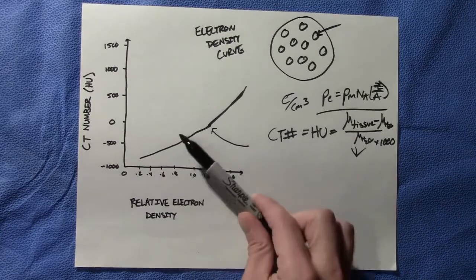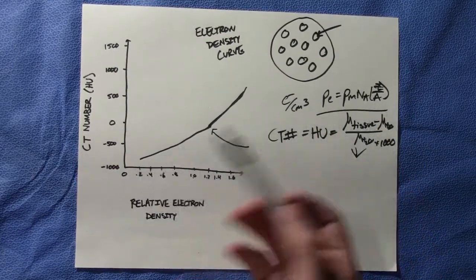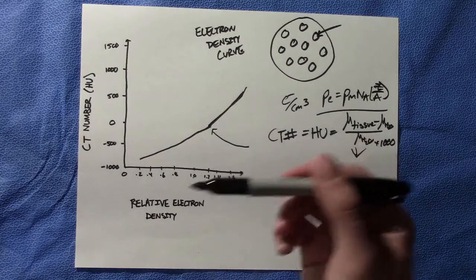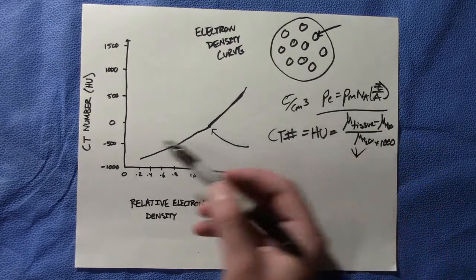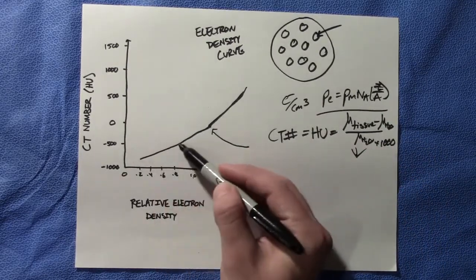So if this is incorrect, it may be looking at soft tissue. It's the dose algorithms, the treatment planning system is going to reference this graph that you've put in, or that has been provided for you, but you spot check, and it may say, okay, it sees an HU number of -500 right here.